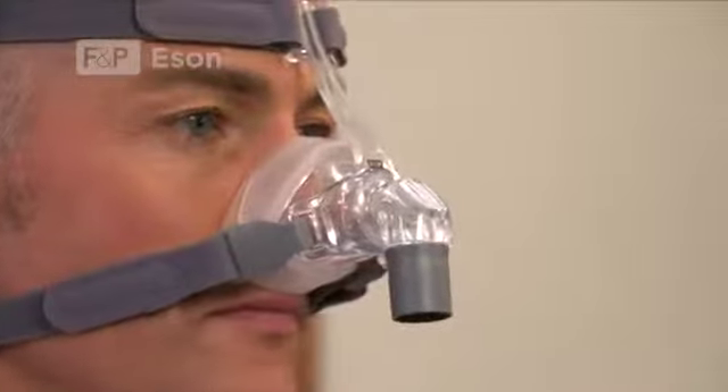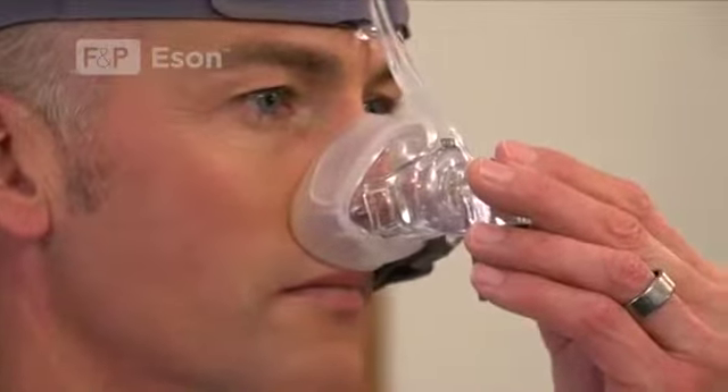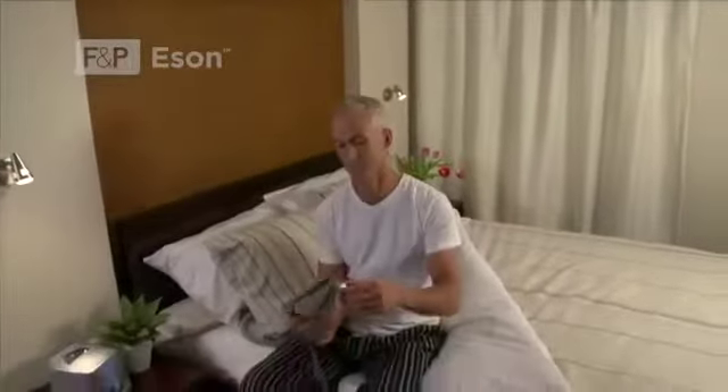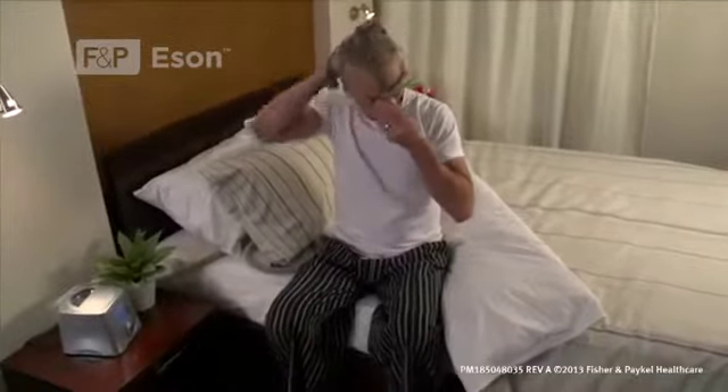These include the roll fit seal, ergo fit headgear, the easy frame with a quiet air diffuser and a ball and socket elbow. In the following segments of this video we will show you how to fit your mask, take apart for cleaning and reassemble it again afterward.